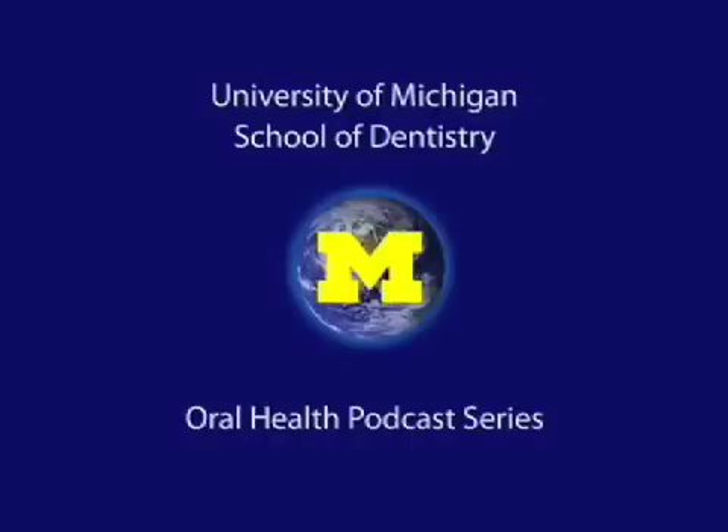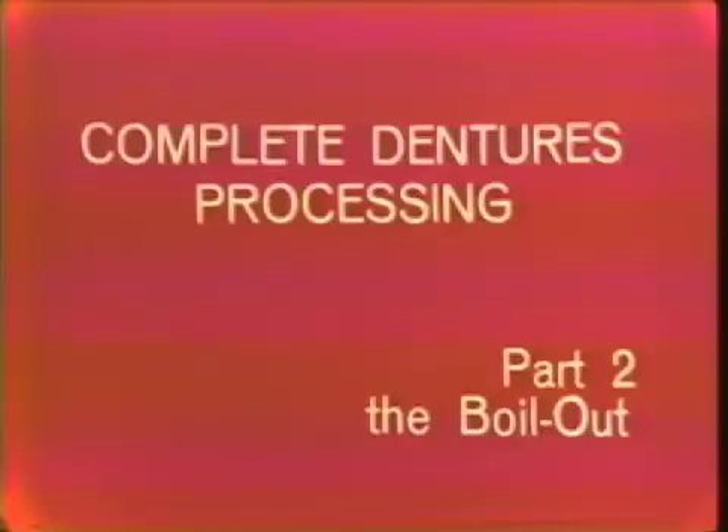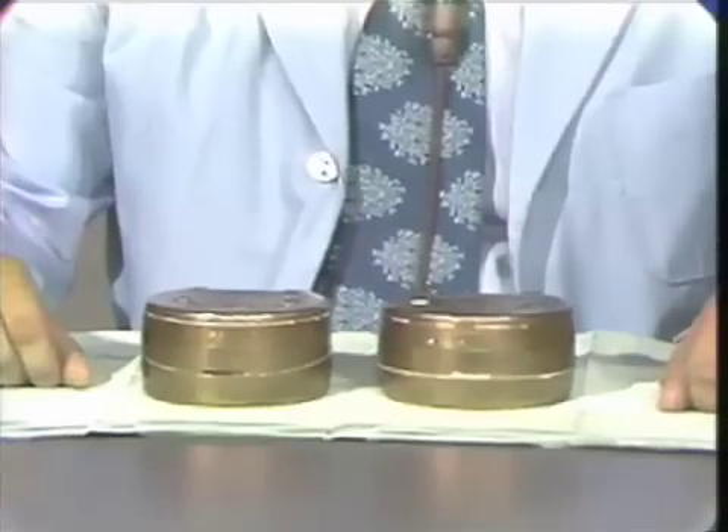Welcome to the University of Michigan Dentistry Podcast Series, promoting oral health care worldwide. In this procedure, I will be demonstrating how to boil out a complete denture prior to processing. In our last exercise, we completed the flasking of the maxillary and mandibular denture following the wax-up procedure.